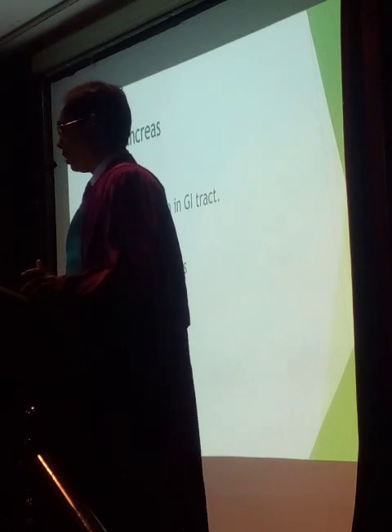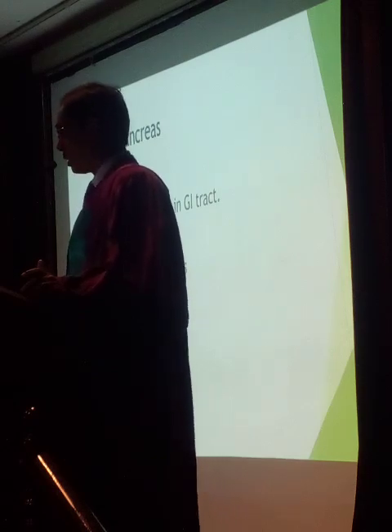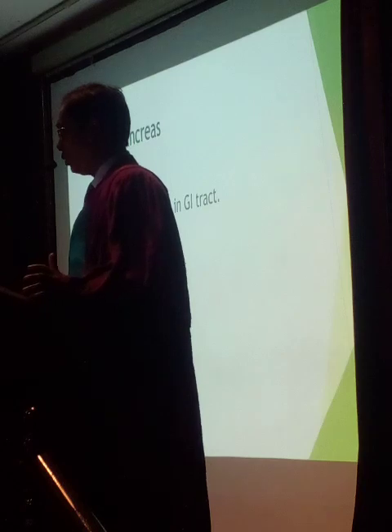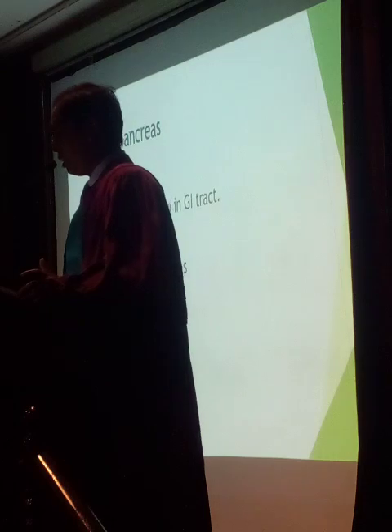So we have to know about the location and structures related to the pancreas when you do imaging and reporting any kind of pancreatic pathology. It's a retroperitoneal structure which is related to a lot of other vital structures, and those details are always needed to plan a surgery or other treatment.